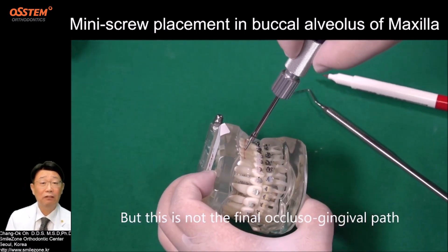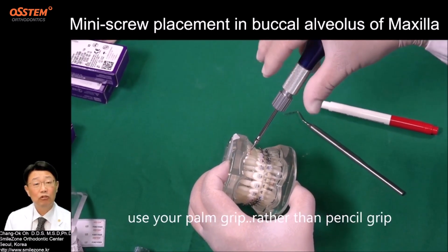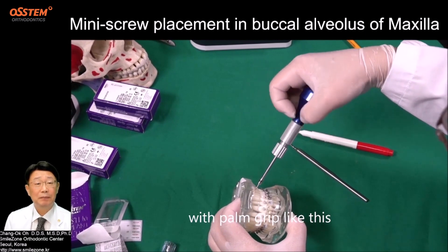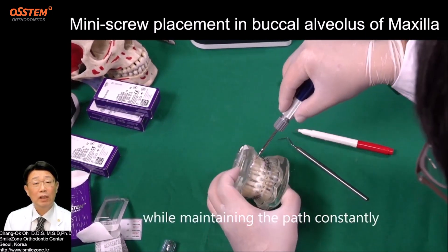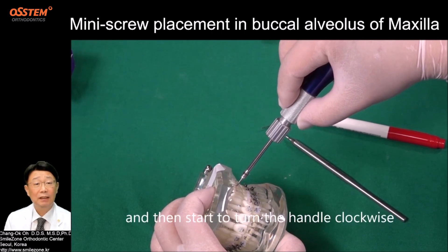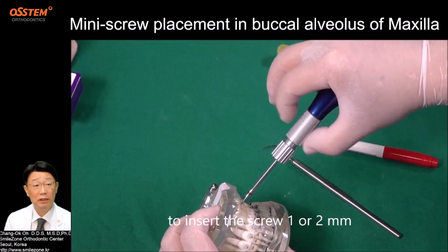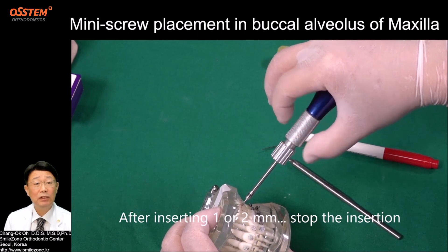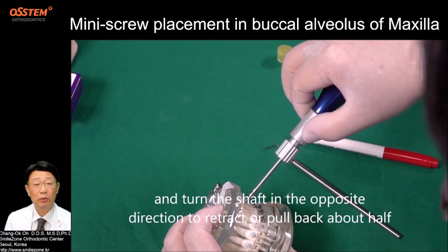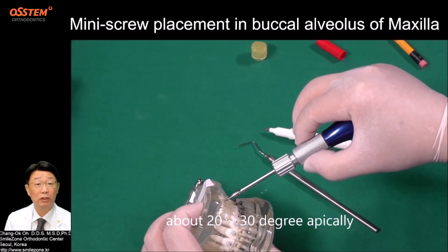But this is not the final occlusal-gingival path. After setting up the initial insertion path, use your palm grip rather than pencil grip. With the palm grip, while maintaining the path constantly, press against the bone gently. Then start to turn the handle clockwise to insert the screw 1 to 2 mm. After inserting 1 to 2 mm, stop the insertion and turn the shaft in the opposite direction to retract or pull back about half. Then change the occlusal-gingival path about 20 to 30 degrees apically.